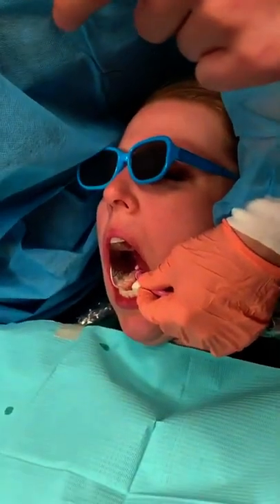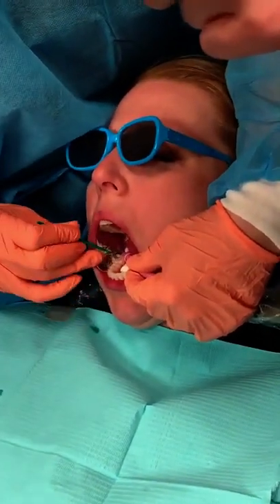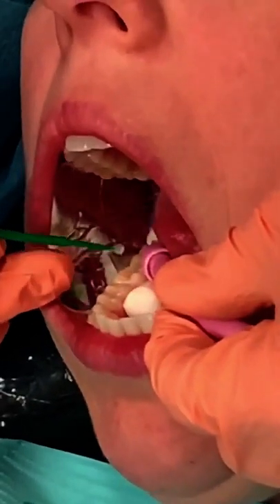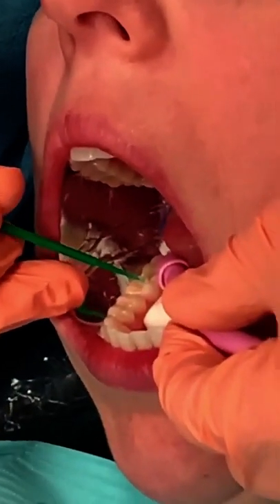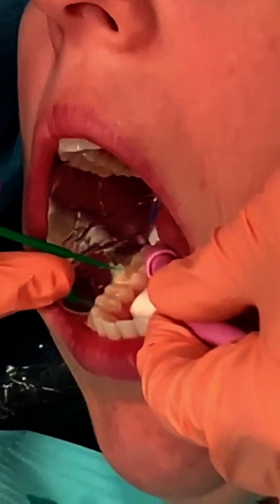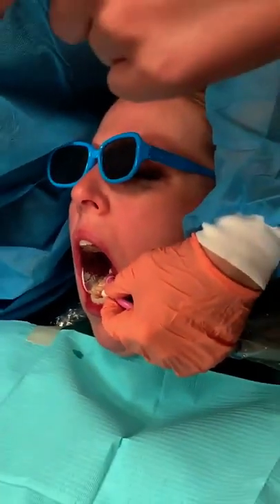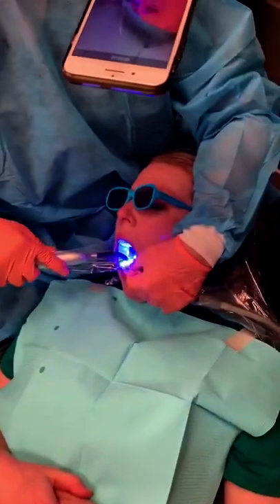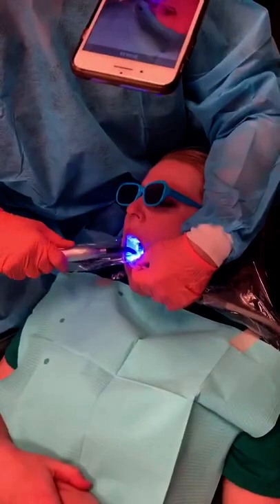I feel like I got a little too much in the middle of the occlusal. If you're using a micro brush, be really, really light with it. I feel like that's good — just going to put some in the fissures. I like to cure molars for a minute — don't look at the light. That's just my personal preference.